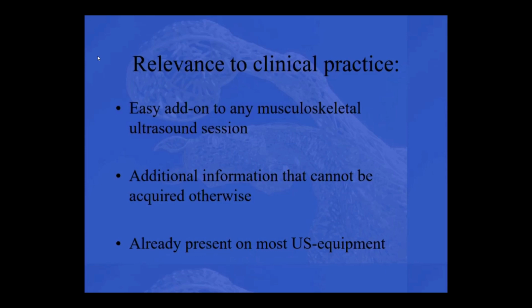So they have a problem deciding which joint to really treat. They used power Doppler to look at synovial blood flow pattern as an indication for having an active joint being more painful. There's quite some literature out there in the human field. It's very accurate in pinpointing that. And our cases are similar. They cannot really tell you which joint hurts the most. Quite often we have more pathology in different imaging modalities, and it makes it difficult for us to make a decision which one of them is really important. And I think power Doppler can really help you.